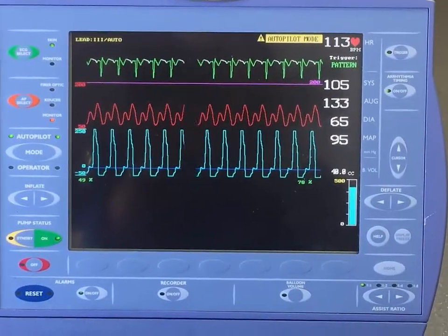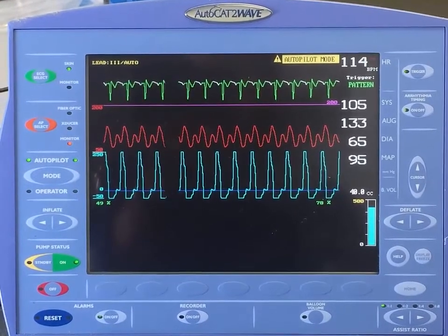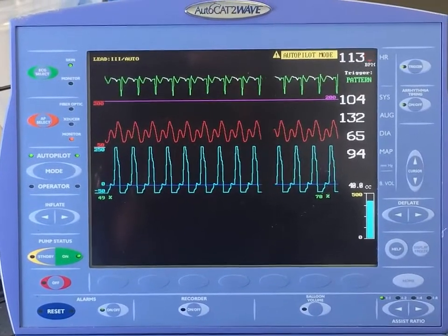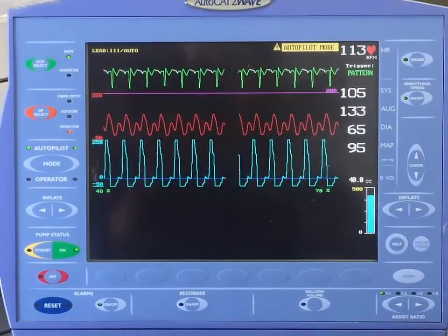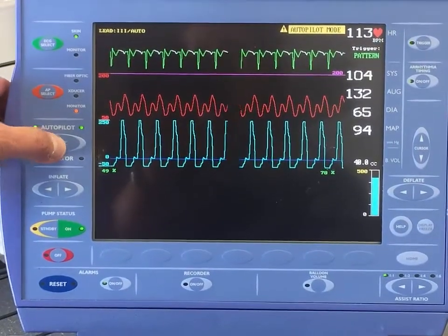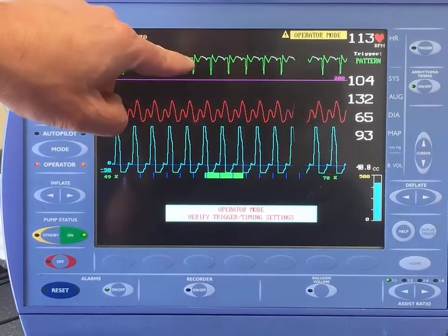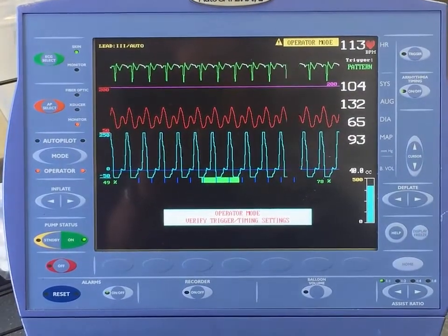Typically in autopilot mode, the balloon pump can time to the needs of the patient far better than we can in manual mode — even in the presence of arrhythmias. But if we decide we need to override it, we can go to operator mode. Selecting operator mode allows us to control balloon inflation and deflation manually. We will time it off the arterial pressure waveform.